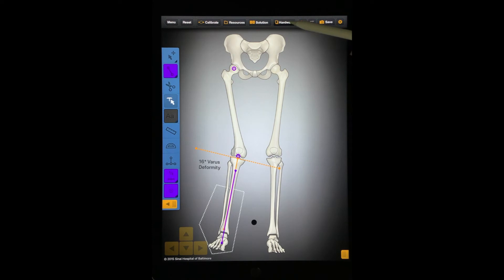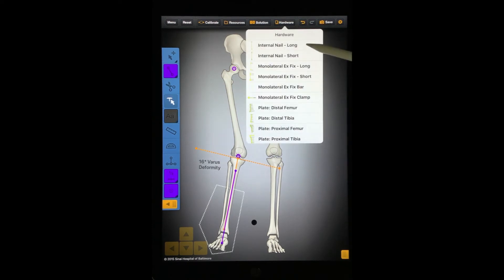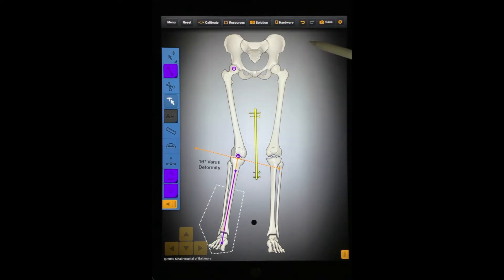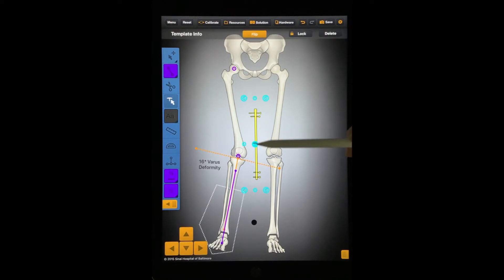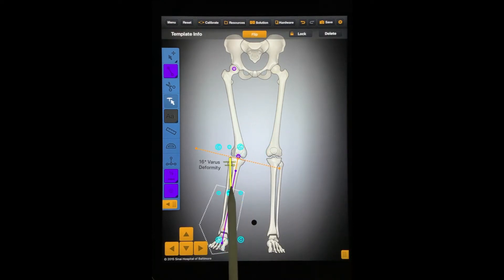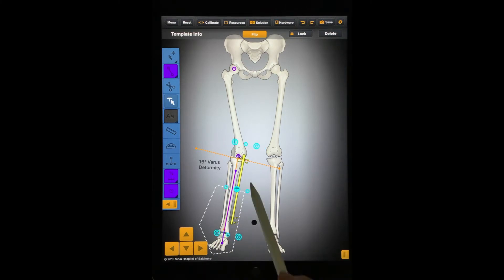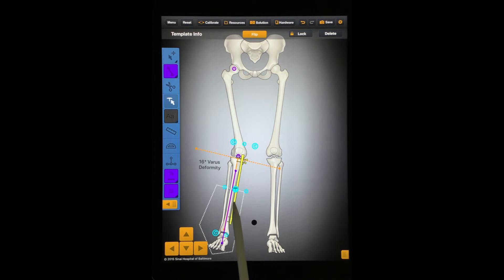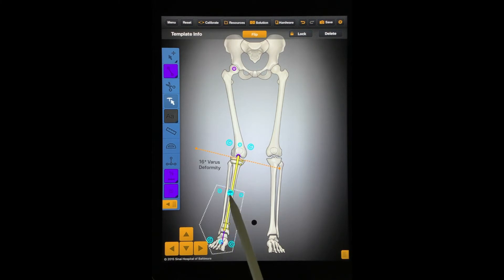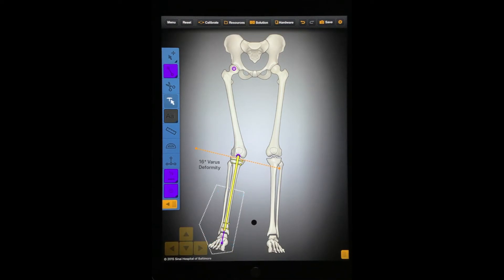Select the Hardware drop-down menu to add generic hardware to your image. This tool is not for surgical planning purposes. With the Thumbtack tool, you can choose a rotational point of correction. Use the rotation handles outside of the selected item to rotate the entire group.